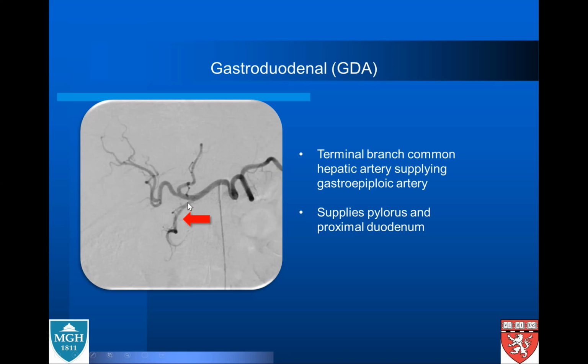One other artery I should mention are supraduodenal branches. Sometimes there are very small branches that just come down, and really that has been problematic for me in my time of treating patients. Not really the GDA, you can always see the GDA, but small supraduodenal arteries can come down and feed the duodenum, and if radiation beads go into that, you can get an ulcer, which has a lot of morbidity. So that's why I always do a cone beam CT now whenever I put my microcatheter where I'm going to inject from, and I really study it to make sure I don't see any of those vessels.